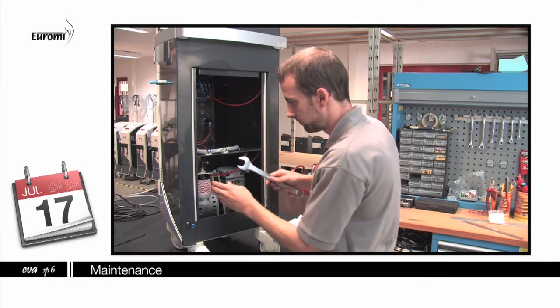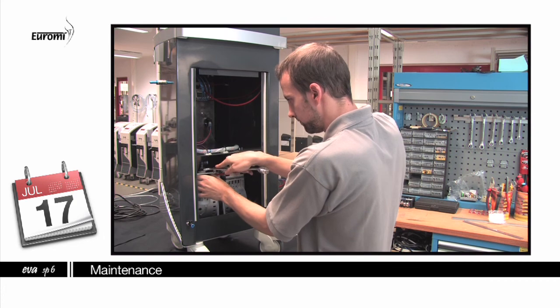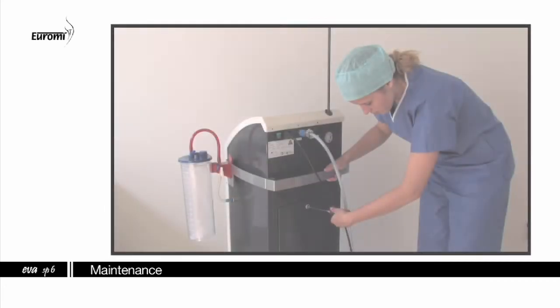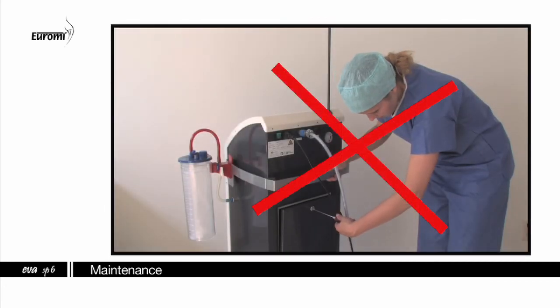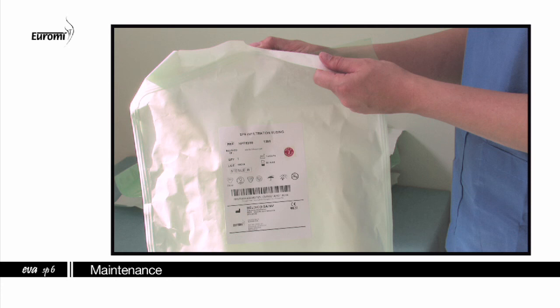Euromi company highly recommends an annual maintenance of your Lipomatic and EVA SP6. Do not open or change the EVA SP6 and Lipomatic. Use only accessories and disposables provided by Euromi company.